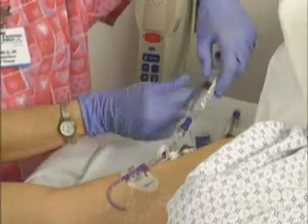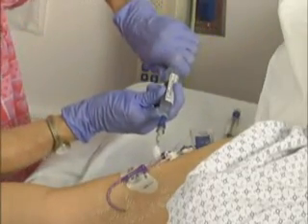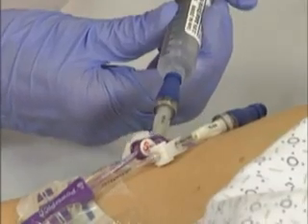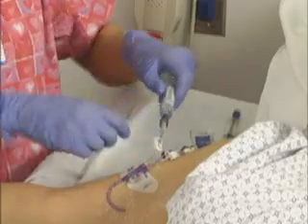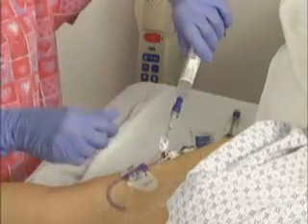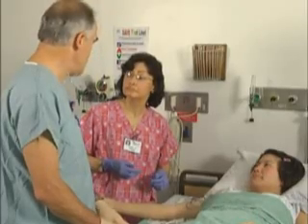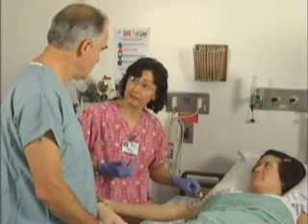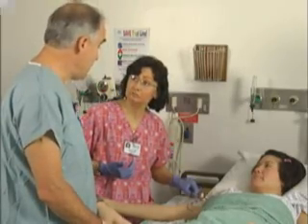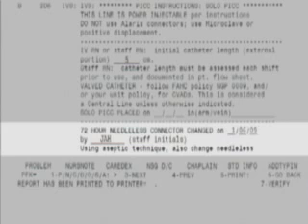Okay, Steve. Do you want me to go ahead and check it? Sure. No, I'm still getting nothing. It doesn't work. Well, I think what we need to do is put some TPA in the line and clear that occlusion. So why don't you call me when it's on the floor? Okay, I will. Steve, is there any place I should document this cap change? Oh yeah, you should document it in the care decks each time you change the cap. Okay, I'll do that.